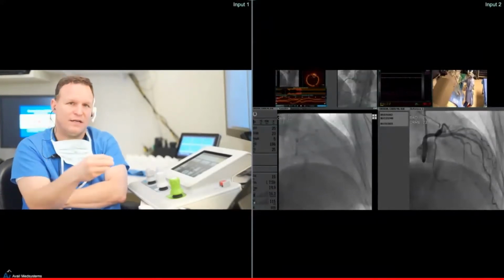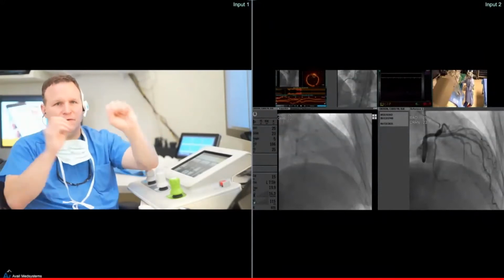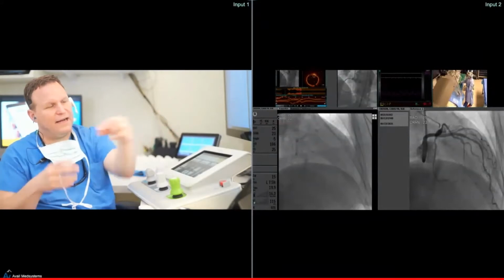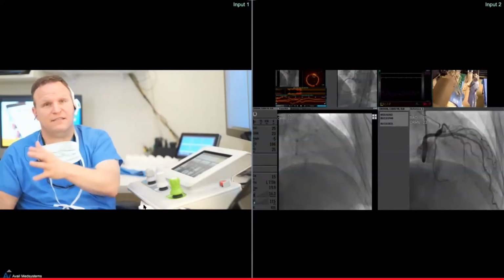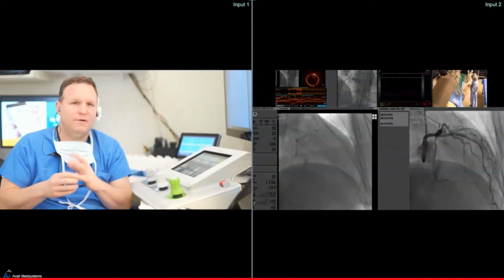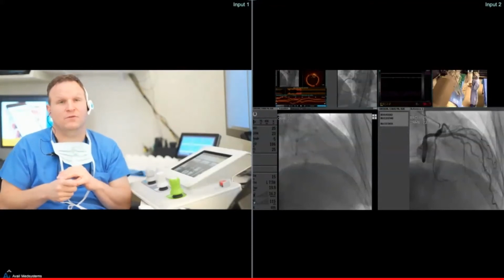So we would cross, once we got the lesion, if it was reverse cart or whatever else, come in and balloon it up. Once we had a track, we would plan on it out of the gate. There's a little dial, a gear that we put on the guider that allows the robot to turn it. We would convert half the cases, finishing them the traditional way, and the other half we finished with the robot. We found there was no significant difference in time. There was a 40 to 50% reduction in radiation exposure to the operator, which we were pretty shocked about. We knew it was going to be something, but we didn't know that it would be significant.